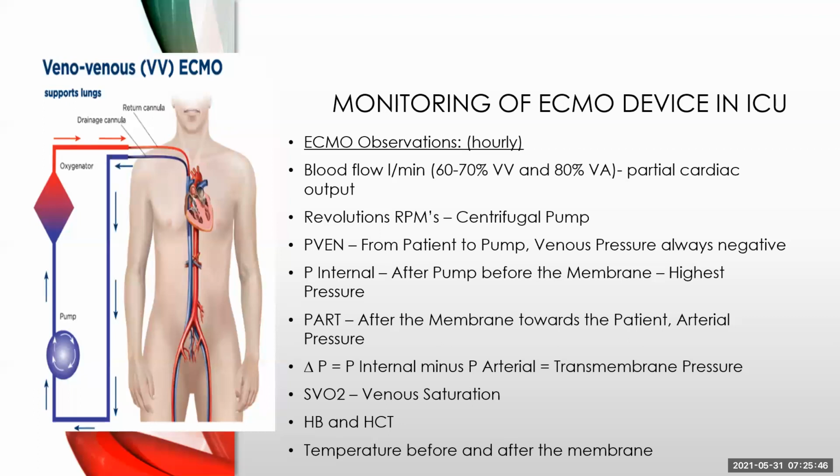See if you can't adjust anything there. There are ways to anticoagulate the membrane if it starts clotting, but we're not going to go into that now, but I can send you some information if you need that. Then the SVO2 is another term that you'll see in ECMO.